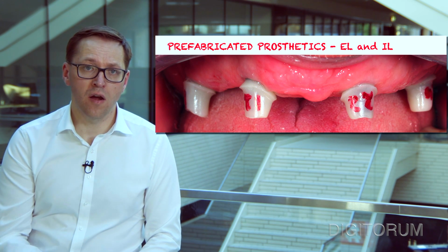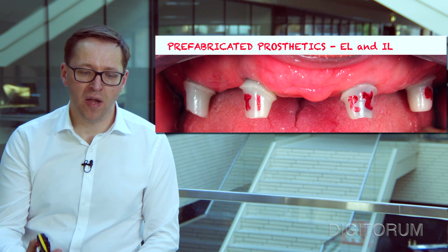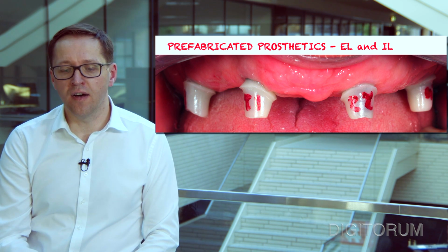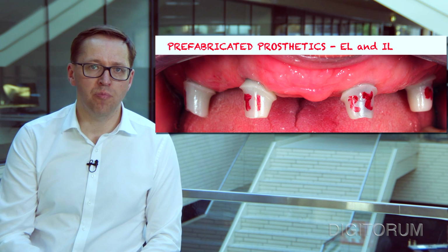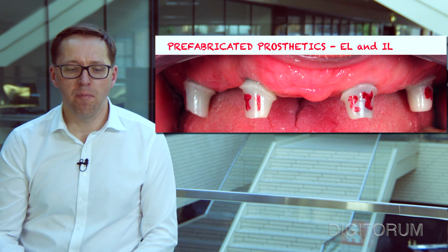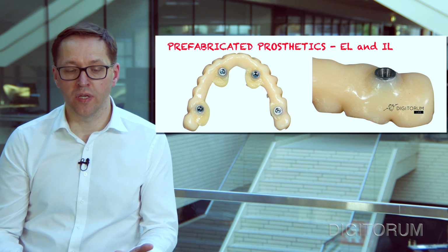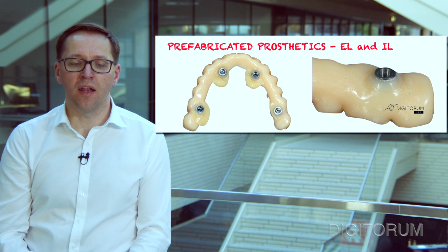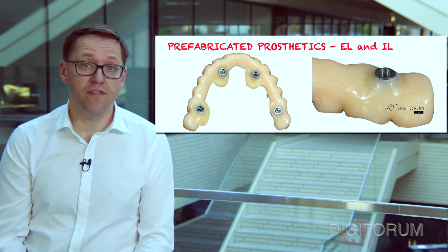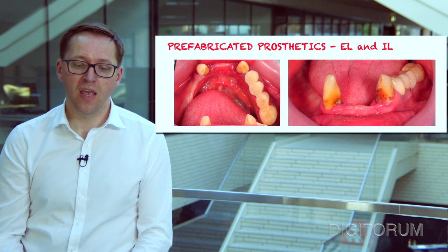So at the uncovery stage, we are able to place these custom abutments which were fabricated before the surgery. With this, our relining procedure is more predictable, not that complicated, not that messy. So we can go with relining, and we can provide the patient a temporary solution in a quite fast way, comfortable for us and the patient.